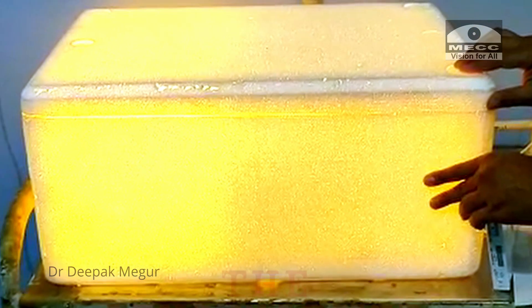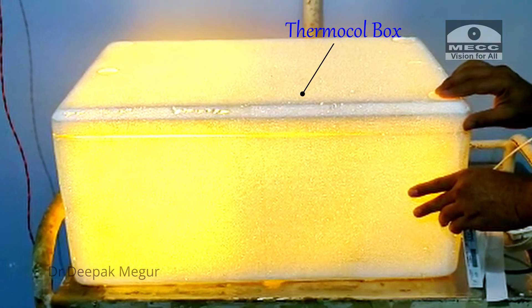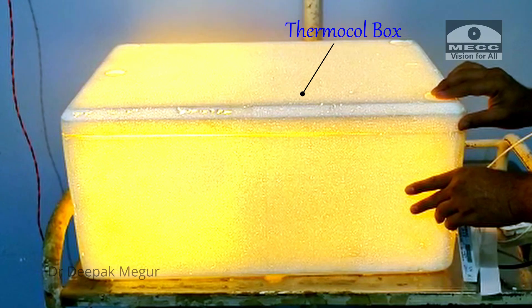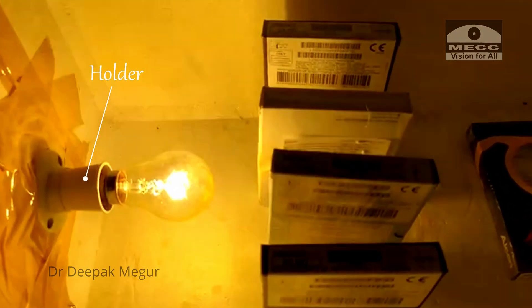Hi friends, presenting the lens warmer. This is just a box with a filament bulb inside, and we use this place to warm the hydrophobic lenses before implanting them. This box is a regular thermocol box which comes with some of the surgical consumables we buy. A small opening is created to fix in a holder and then the bulb.